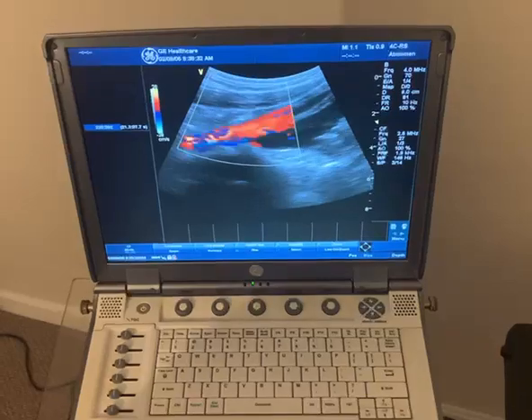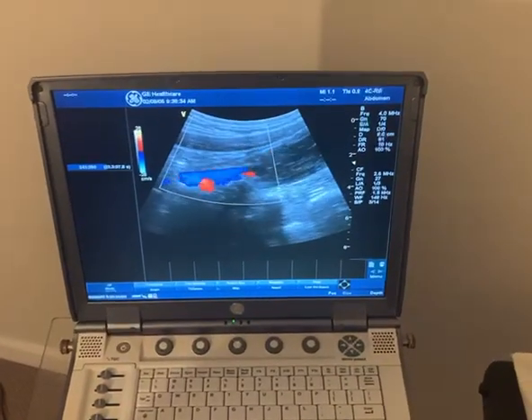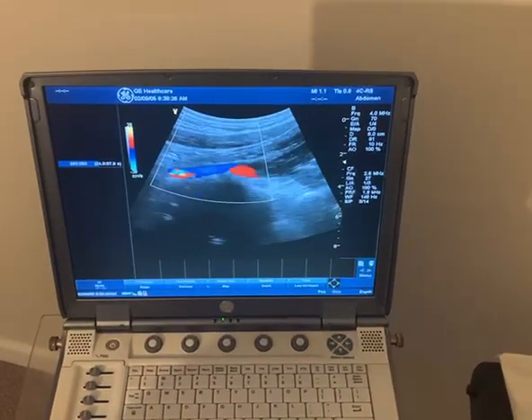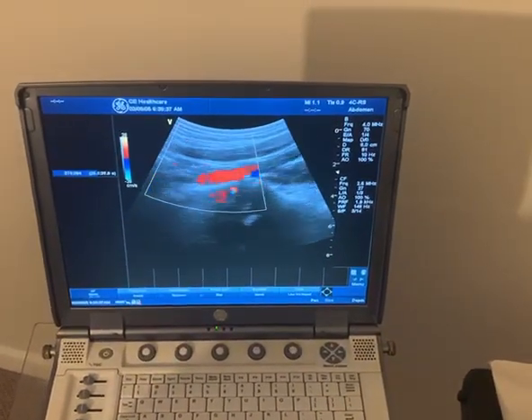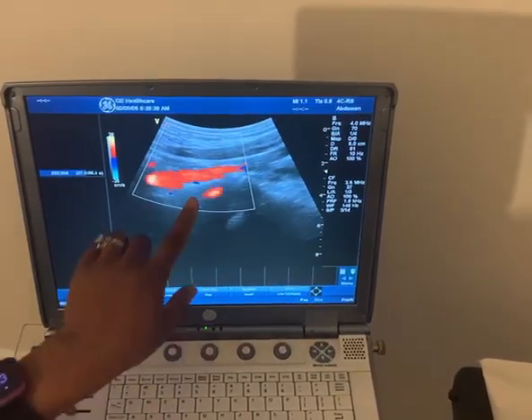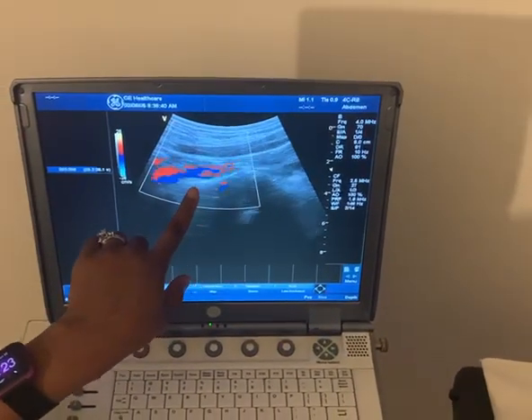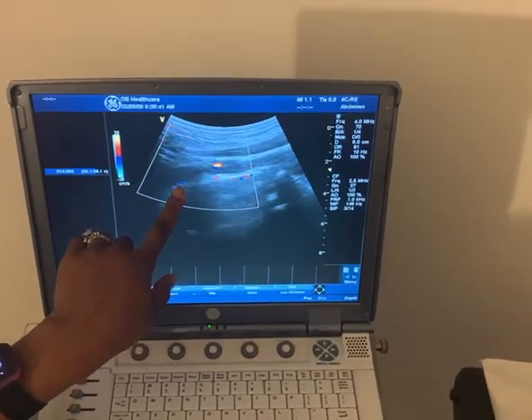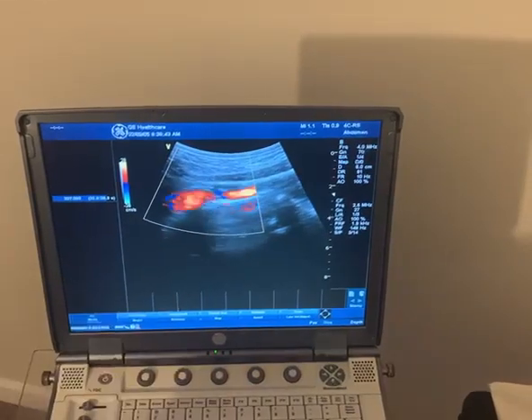As I rock the probe up a little more, I have to push to get the gas out of the way. At this point I have my common iliac artery, and I can also see my distal aorta at that segment.